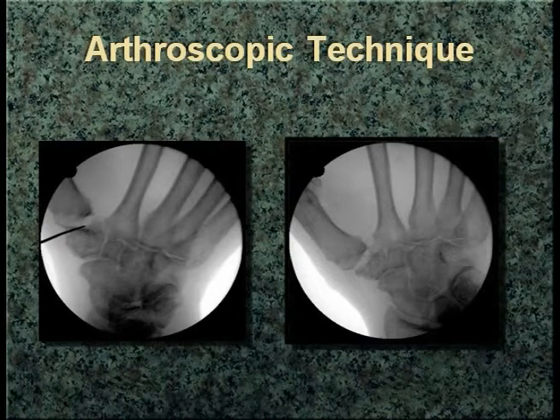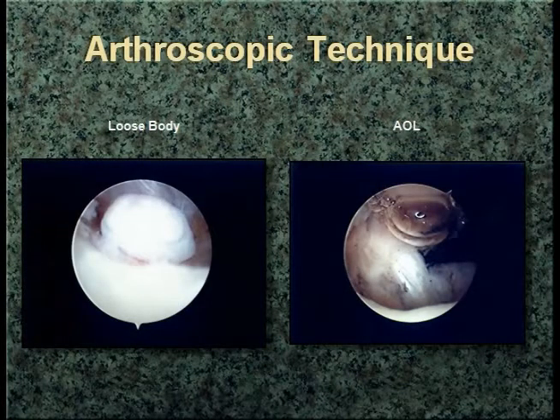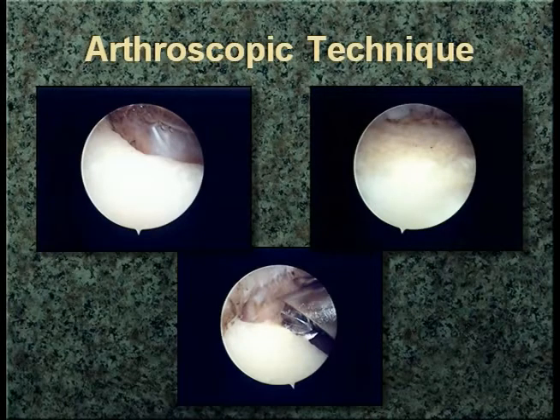Here you can see an example starting out — the needle being placed into the CMC joint to be sure we're in that joint, not the ST joint. I do actually use this arthroscopic technique for ST arthritis as opposed to doing a formal fusion. You can see the before and after on the right after interposition and placement of a dermal graft. You can see loose bodies, you can see the AOL. These three pictures show at the upper left where you have the typical saddleback deformity. The burr comes in after initial synovectomy, bringing us down to a cancellous surface that would potentially allow for healing.